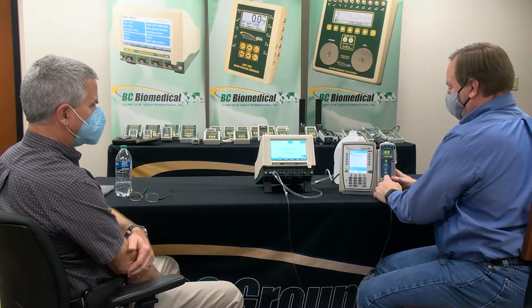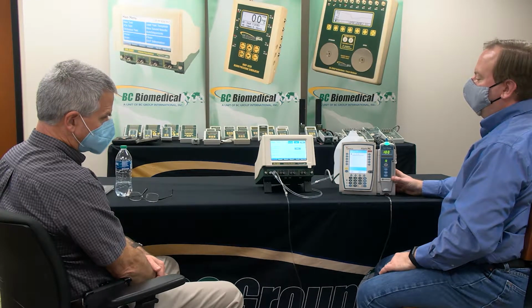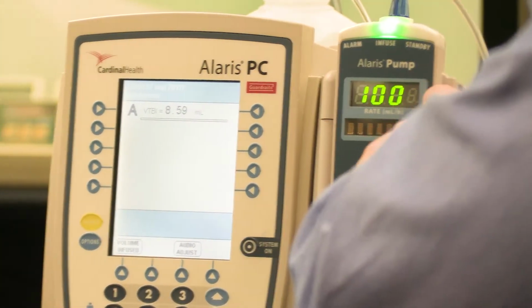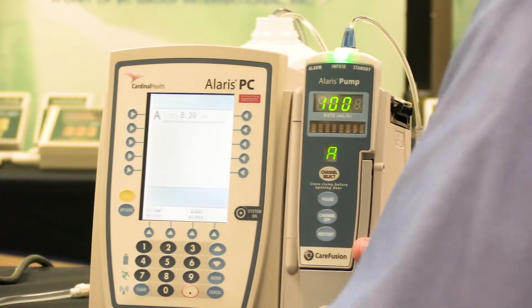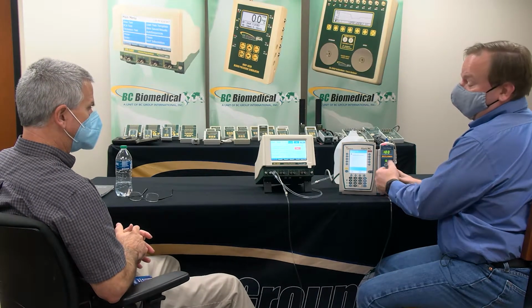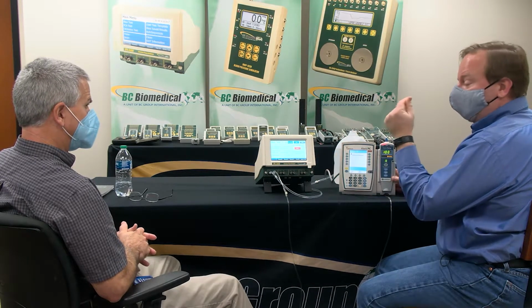It just took a little longer because the volume was lower. I wanted to show that based on the flow rate, that pressure may change. Now it's got more time to monitor. Oh, it's gonna be right around 11. Okay, 11.5 again? So it's consistent, right? So maybe that's the spec for this unit. So I guess it's pretty good because it didn't care whether it was 600 or 100. At 11 PSI, it was done, it stopped.